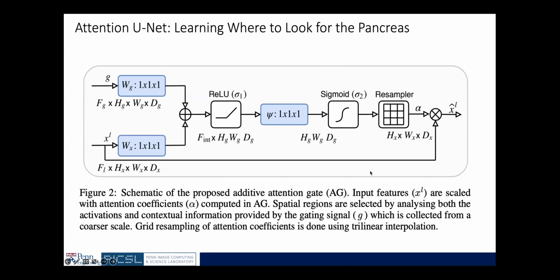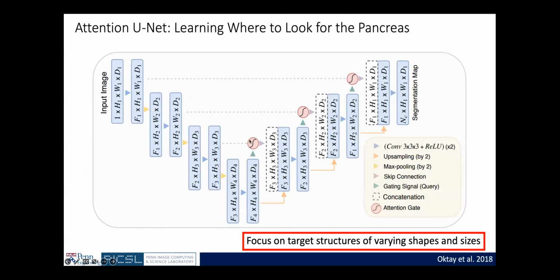Take this feature map, this feature map, and this feature map, and add them together. This is voxel-wise addition. Then whatever feature you get from that, you multiply with that additive component to get a feature which you can then concatenate over here. So it's just small architectural variants, but the basic architecture still remains a U-Net, right? Or an autoencoder.